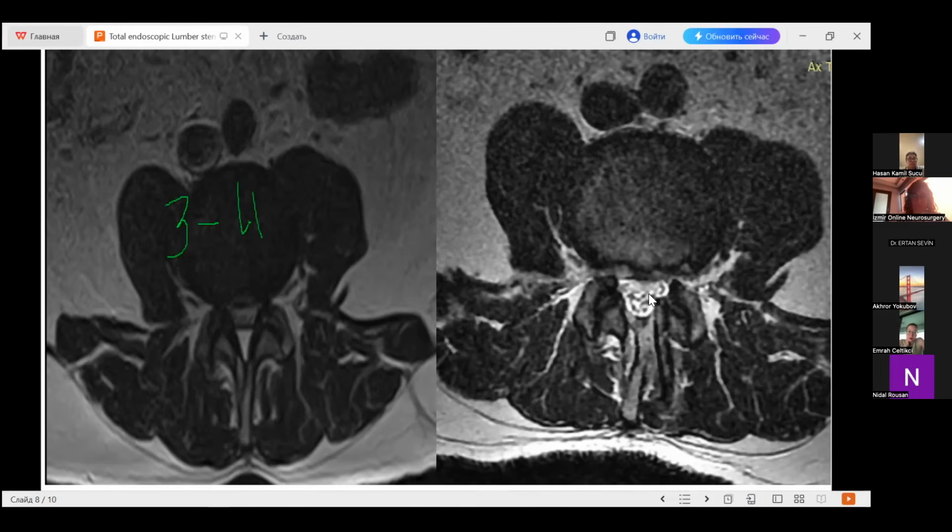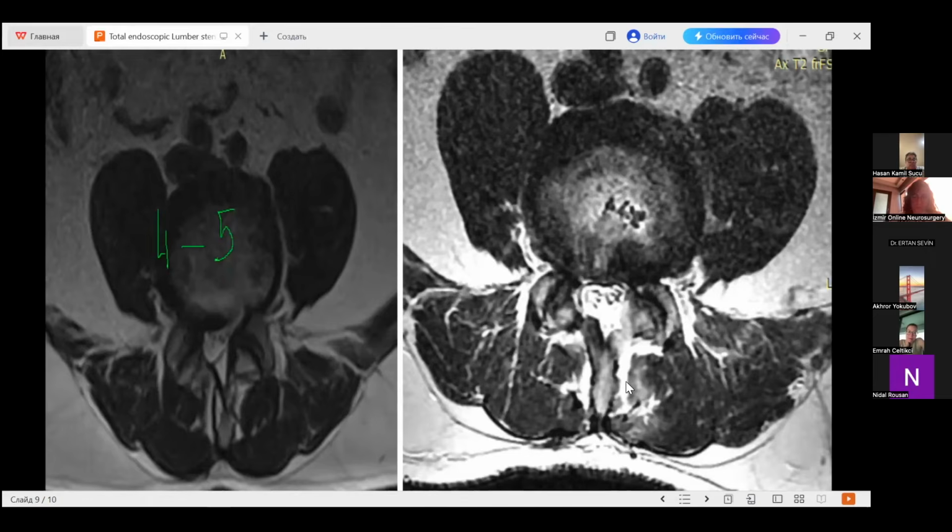Here is the fluid flow. And here also you see no muscle damage. This is a more important part also. This L5 is found on the left side. I did only lateral recess stenosis here, because the patient before surgery had no symptoms, only claudication. I tried to open this part also, because sometimes after surgery it will irritate. That's why I did it in one surgery.